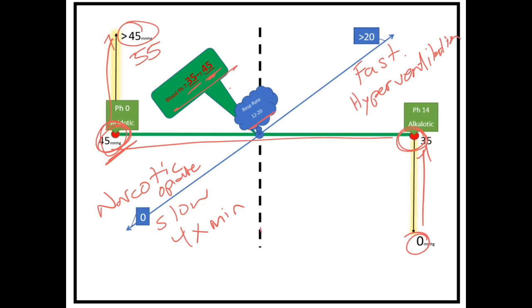What you need to do is look to the other side. You draw your attention over to this side, and all you have to do is speed up their respirations. What about the opposite? We have hyperventilation over here, and we know that their end tidal is going to be down here somewhere, let's just say around 20, and we're like, this is not good. We need to fix this. So we have hyperventilation. We need to slow them down. So you look at the other side of the equation.